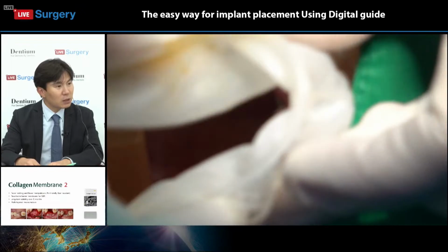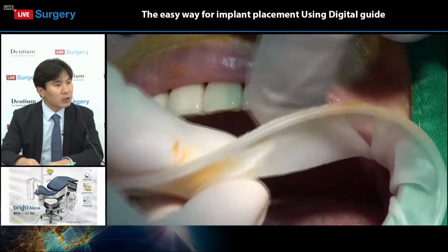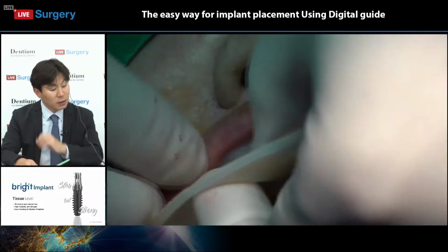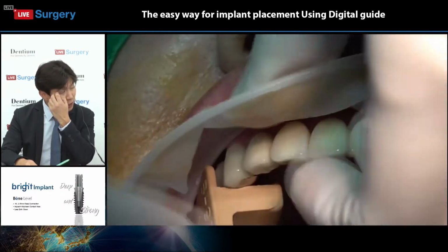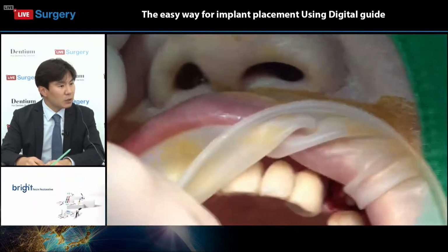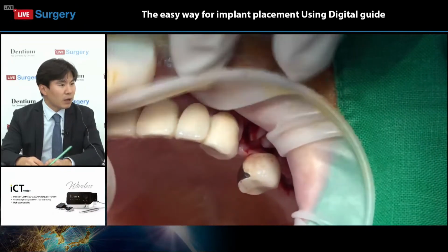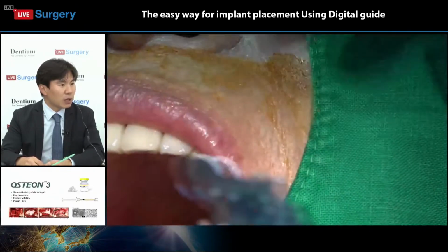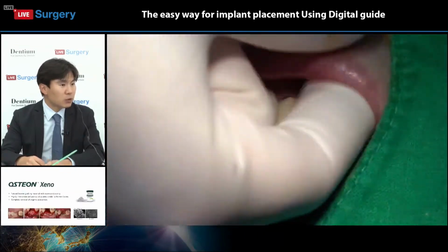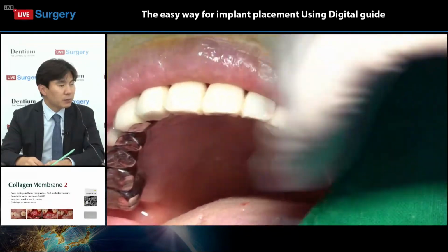And you can see the device retracting the patient's lip and cheek. The device is called Obturagate. And this is a latex-free cheek and lip retractor. For me, I sometimes use this kind of retractor when I do intraoral scanning. It is a good device to have better visibility.